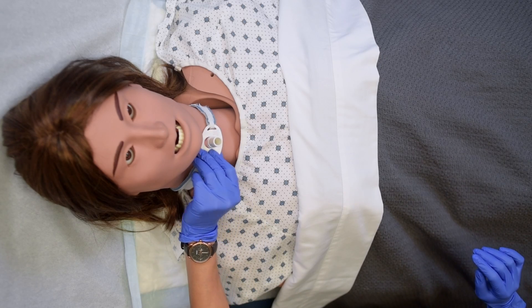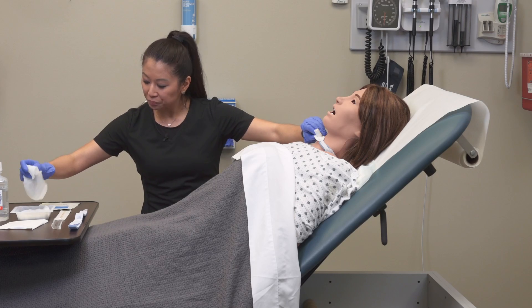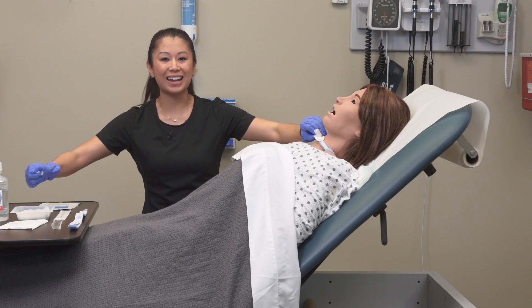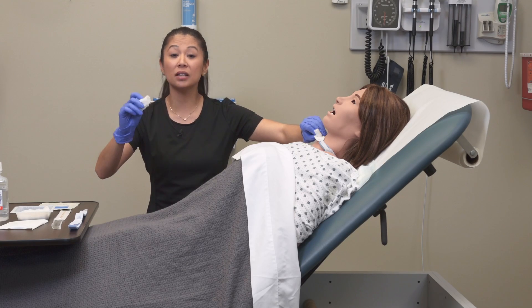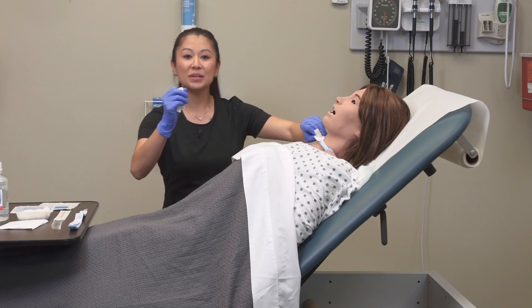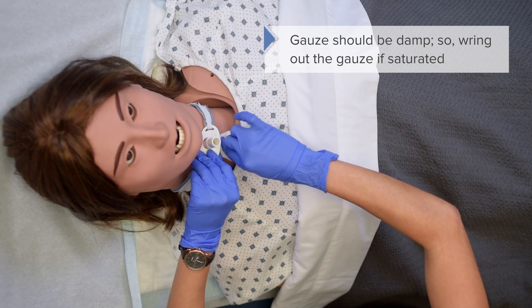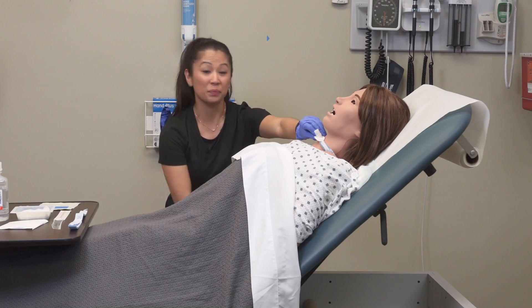I'm going to take this hand and lift up that flange and use my moistened gauze. If it gets too overly saturated, you want to wring it out — you don't want too much moisture going down their airway, so just a little bit damp is great. I'm going to get under there and wipe the patient's neck, and go ahead and use another wipe as well.